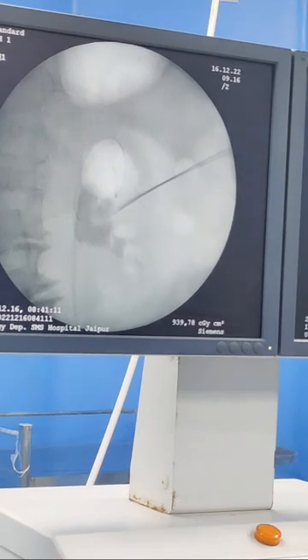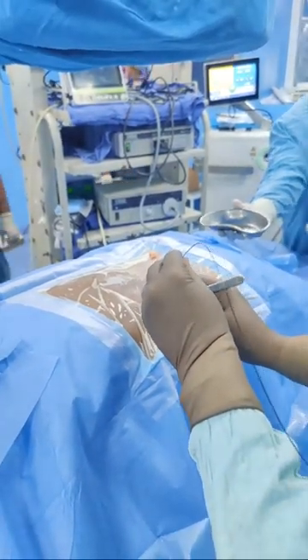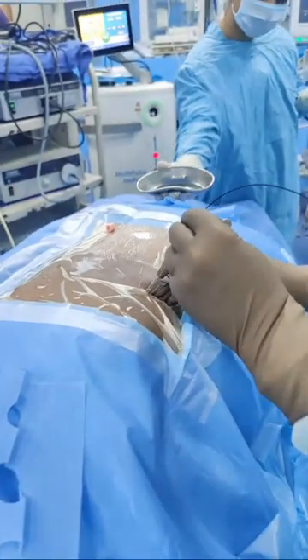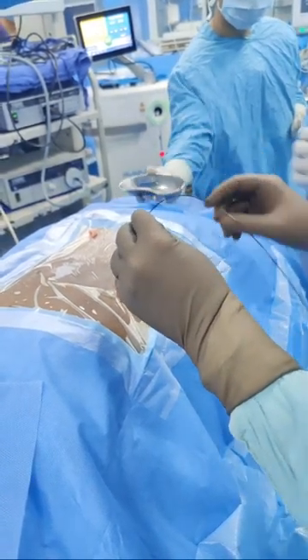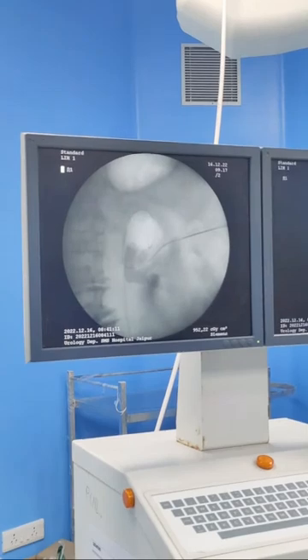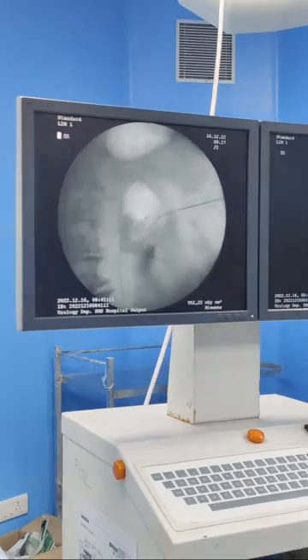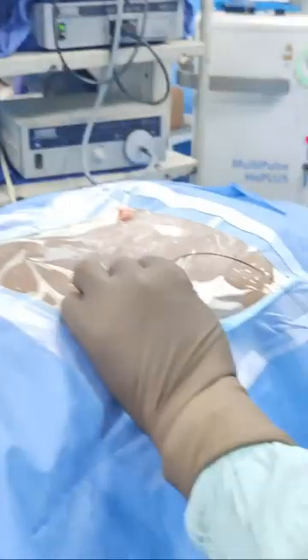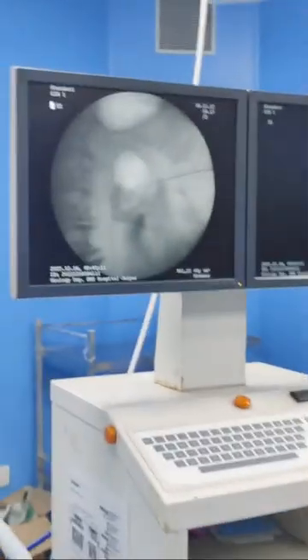Nice place. This is great. If you see, the guide wire coils beautifully from the middle calyx into the upper calyx and rotating. So this is a perfect puncture, and now he has made a hole. So we have just gone through the middle calyx and the guide wire. We have used a Terumo guide wire here, and this is coiled in the upper calyx.